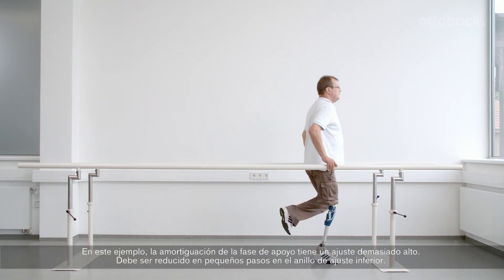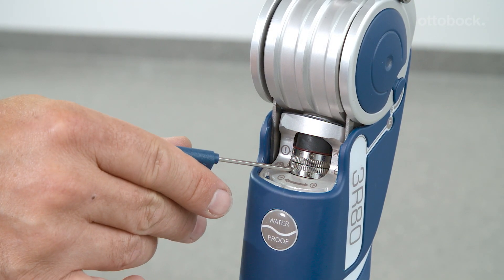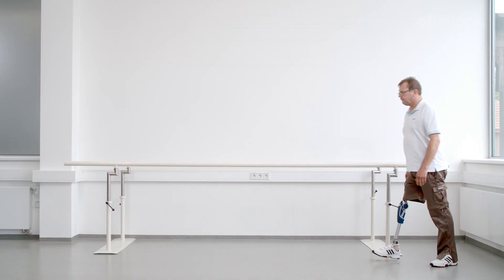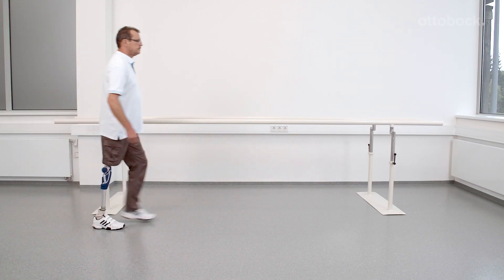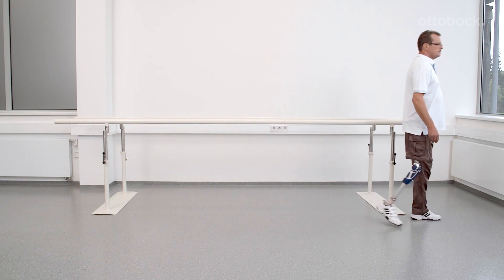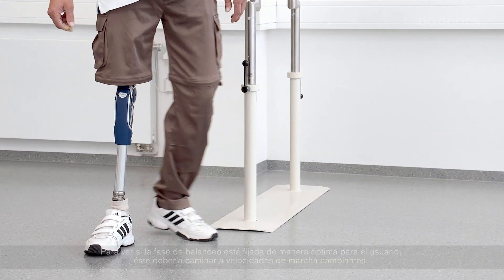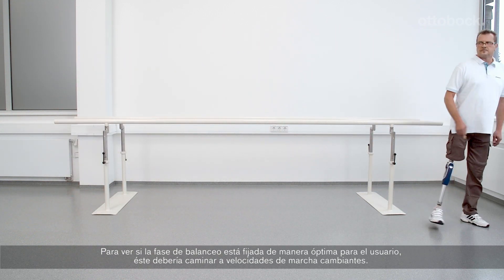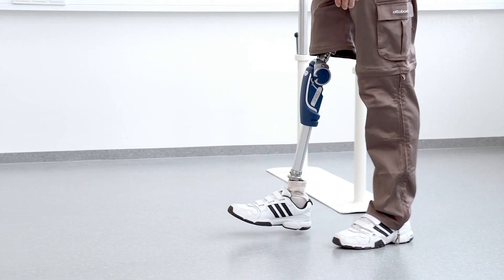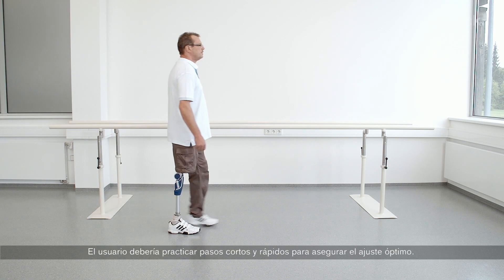In this example, the stance phase damping is set too high. It needs to be reduced in small increments at the lower adjustment ring. To see if the swing phase is set optimally for the user, the user should walk with varying walking speeds. The user should also practice small and quick steps to ensure proper settings.